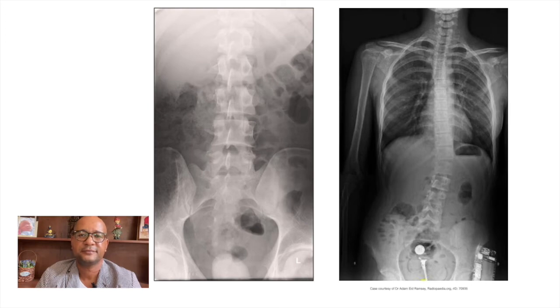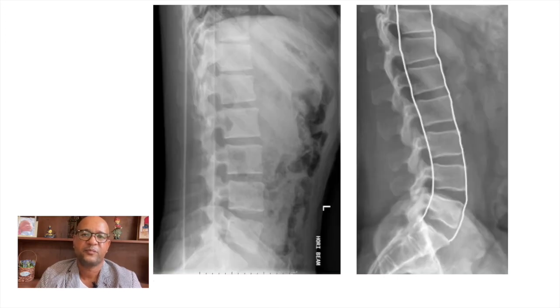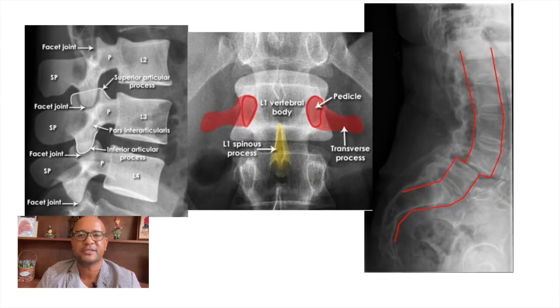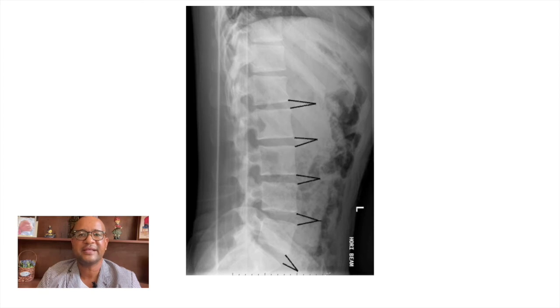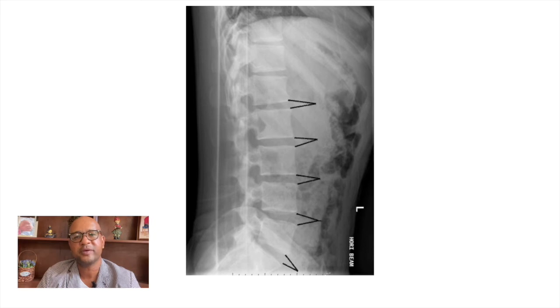The lateral view is the best projection for showing loss of disc space, degenerative changes, or subluxation. One should first check for alignment of the vertebral bodies, and then each vertebral body, disc space, posterior elements, and transverse processes. Disc spaces should gradually increase in height from superior to inferior in the lumbar spine, with the exception of the L5–S1 space, which is sometimes less than L4–L5. The pedicles gradually become wider from superior to inferior.